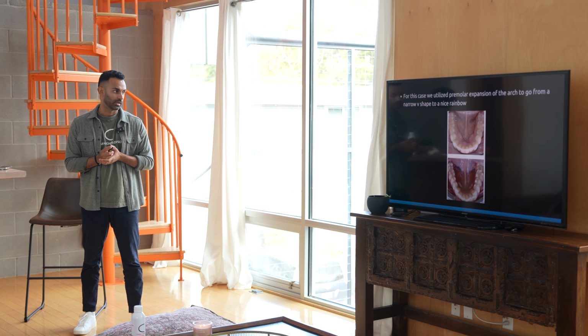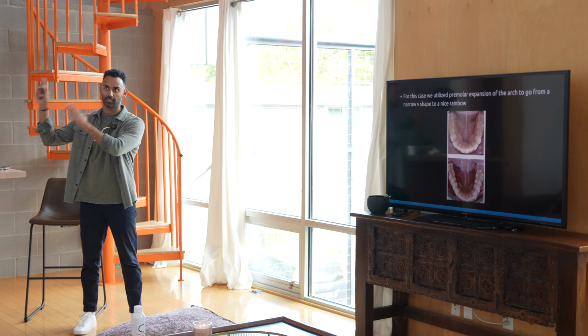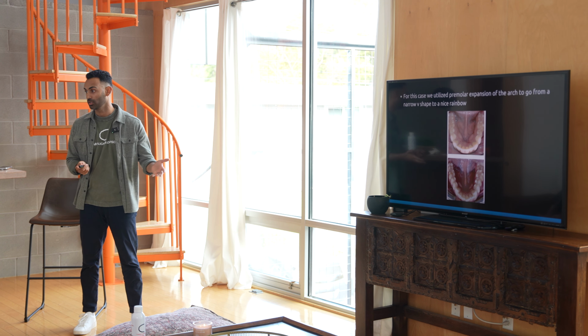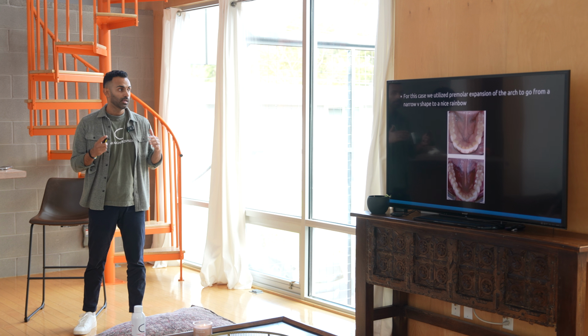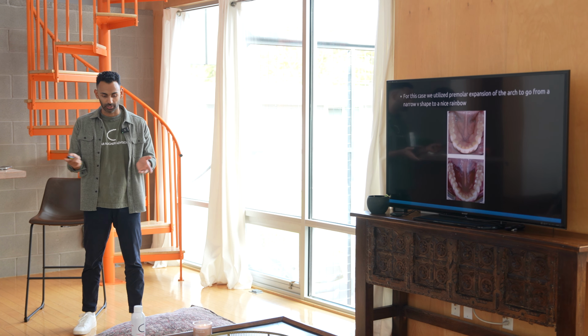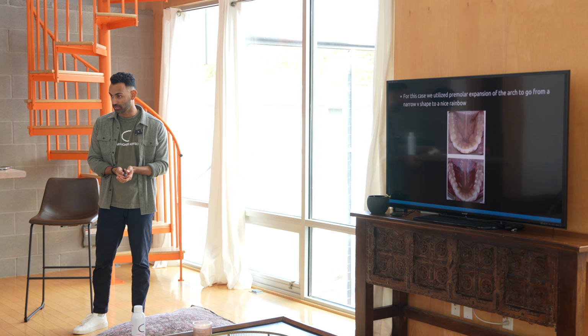Well, the way aligners work is just because you see it on the graphic doesn't mean that it's actually going to happen. And so this was a case where I actually did it early on, and I got lucky in that regard because, and this may happen to you guys too, I saw the animation and I'm like, this looks great, let's do this.